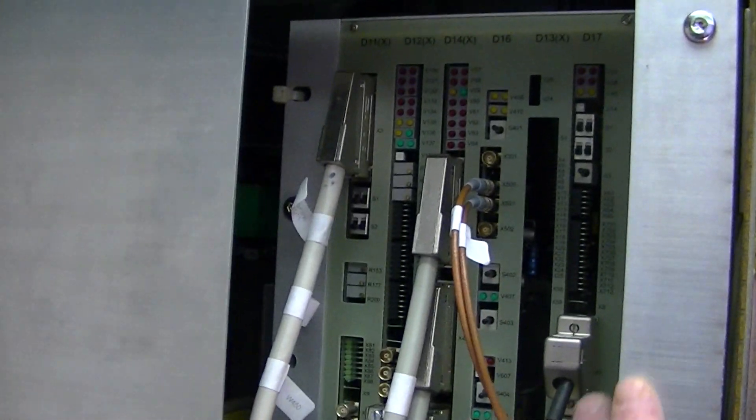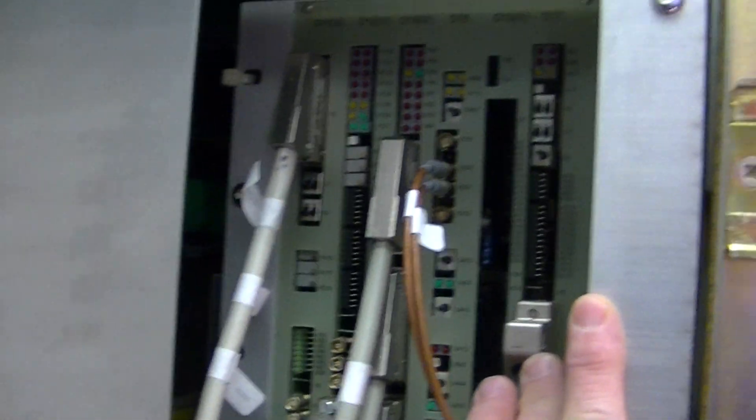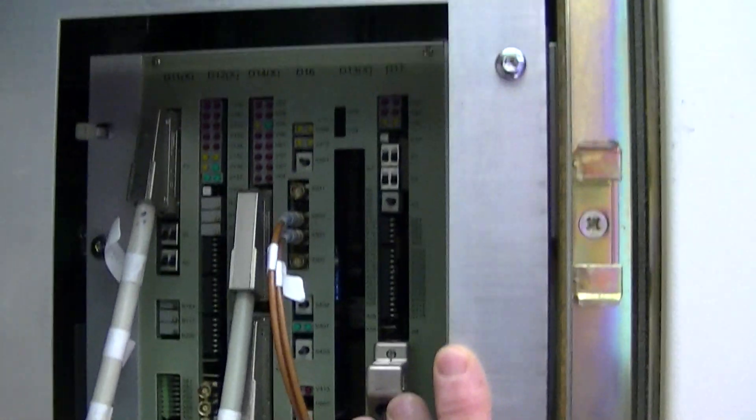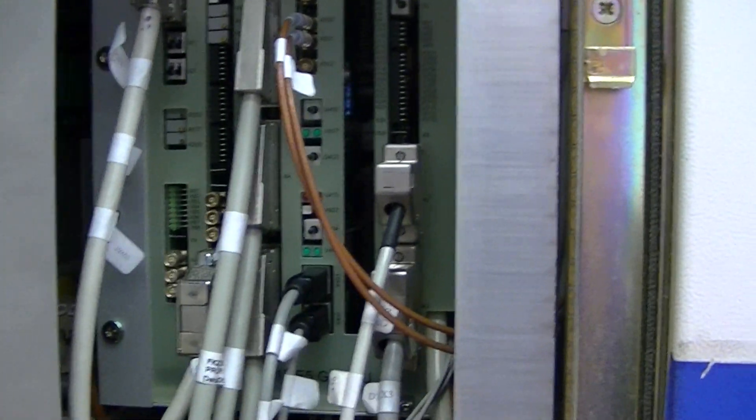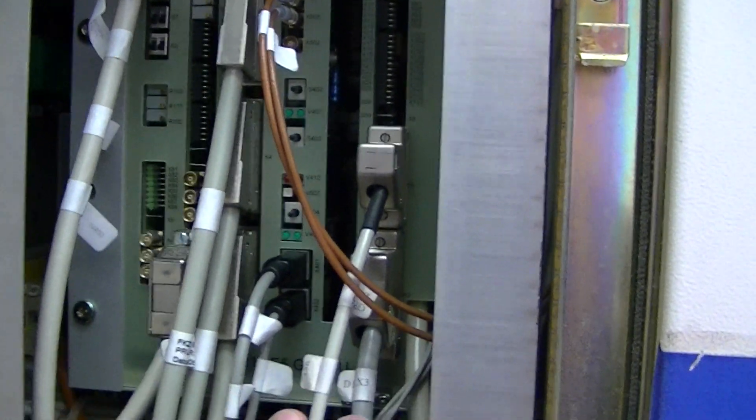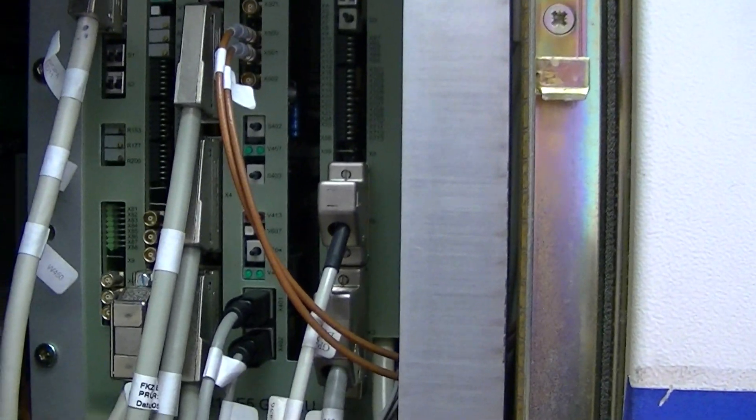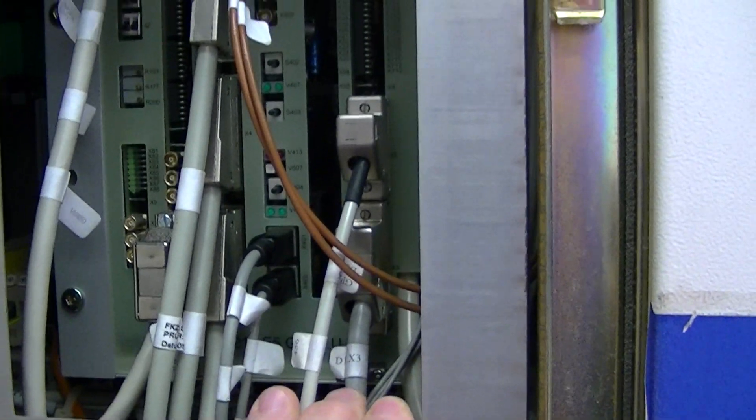This is the D17 board over here. This is what is called the input output board. This has all your service mode features on it.